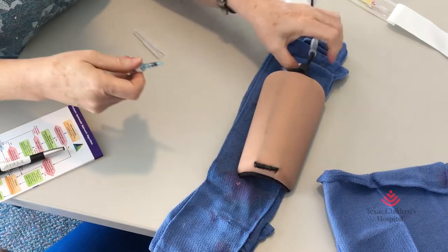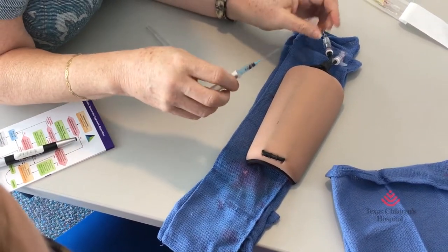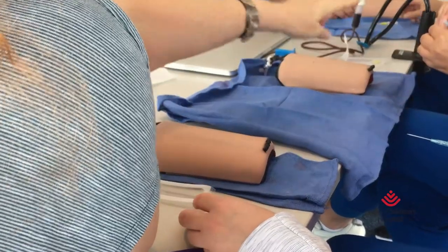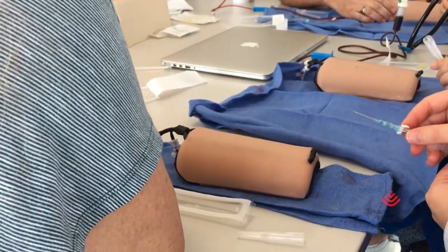The first time that happens will be the last time — I'm telling you, you won't do it again. It's not pretty. Be the button. Can you keep your fingers off the button? Don't do it. So I get irritated when the button pops.